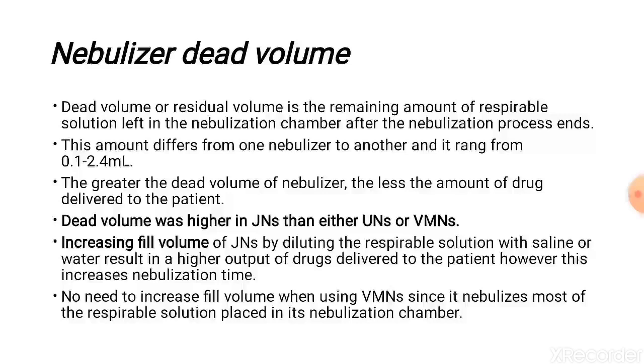Nebulizer dead volume: we have two nebulizers actually used with these patients. Vibrating mesh nebulizer, which has a very small dead volume of around 0.1 mL, and jet nebulizer, which has about 1 mL or half a mL dead volume. So try to choose carefully, not just money wise.